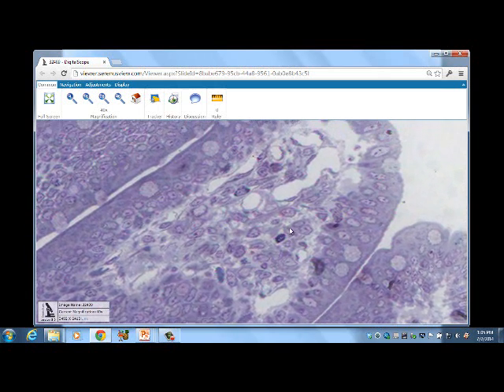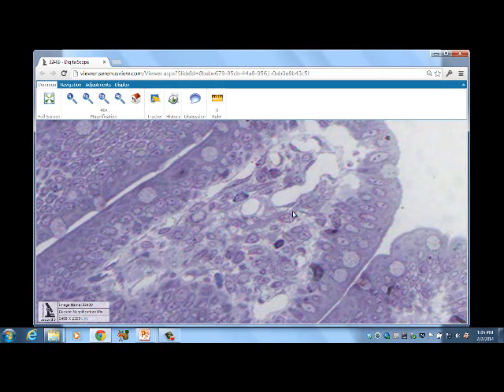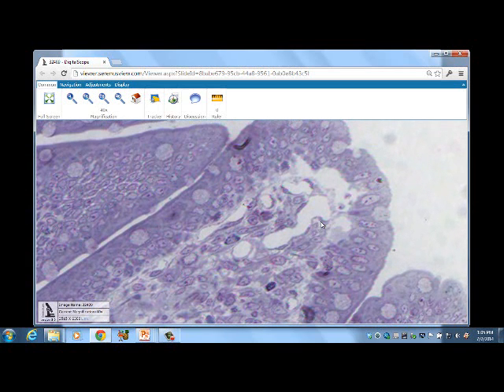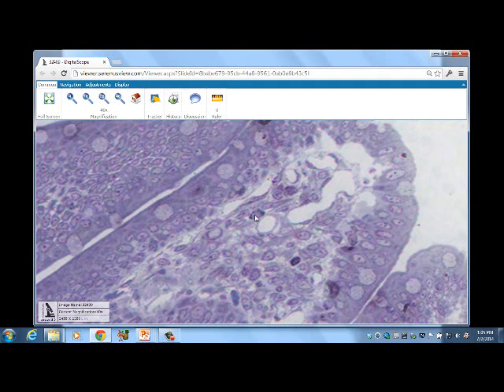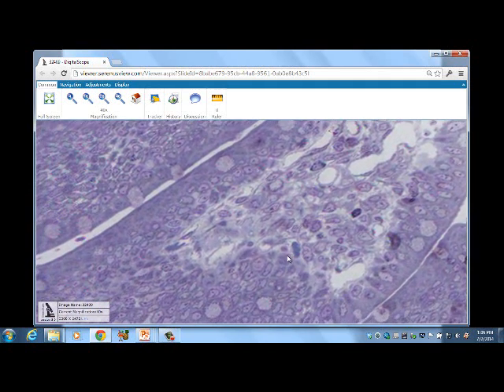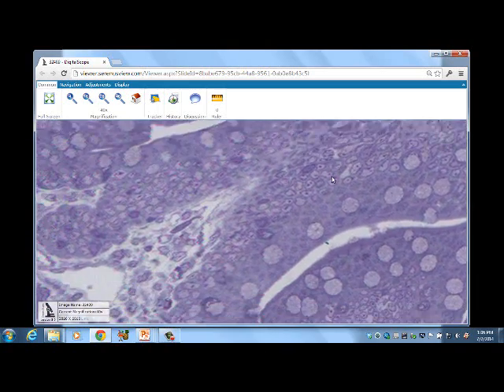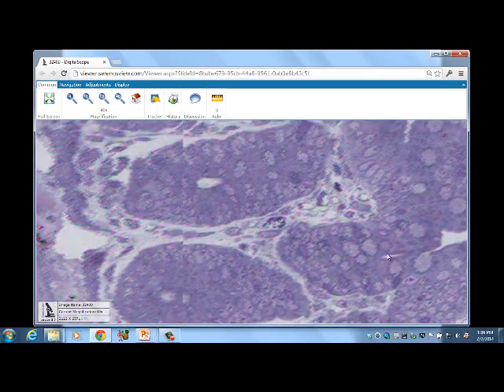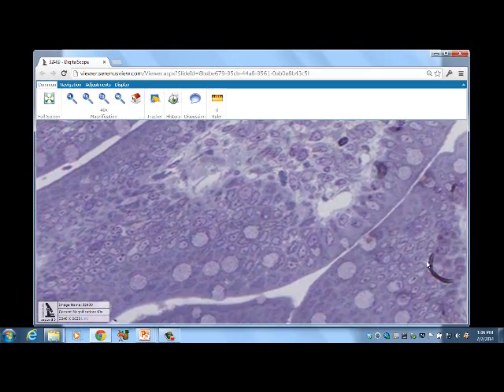In the lamina propria, we can see some smooth muscle cells running through there. We can see endothelial cells, which are flattened cells here, flat as opposed to columns, like we talked about with the epithelium. Endothelium also comes from the mesoderm. That's why we call this epithelium an endothelium. Here's more endothelial cells. You can see the nucleus there, and these cells with the granules inside there are mast cells, connective tissue cells, goblet cells, intestinal absorptive cells, and so these are the different cells that we can see.